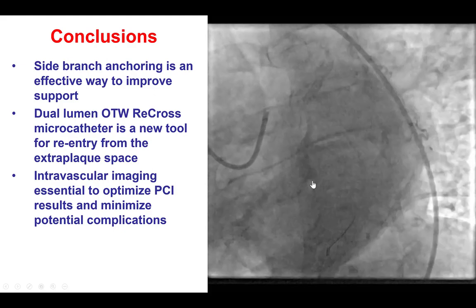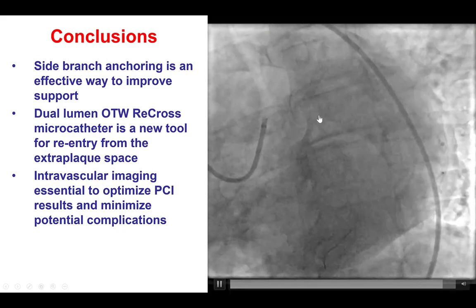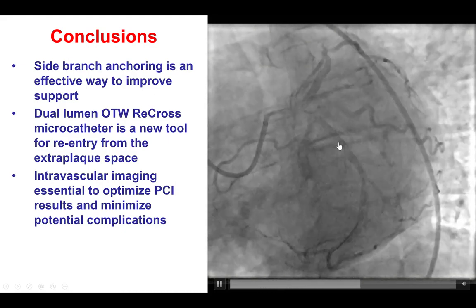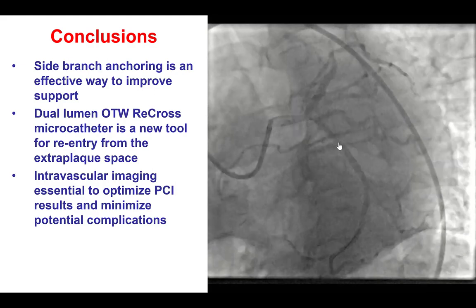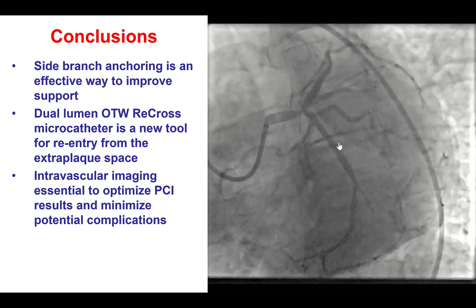Several lessons from this case. The first one is that when there is extraplaque entry, re-entry is one way to go. The other option would have been retrograde crossing, but this patient did not have a good retrograde option with only epicardial collaterals, which is actually something fairly common for circumflex CTOs.